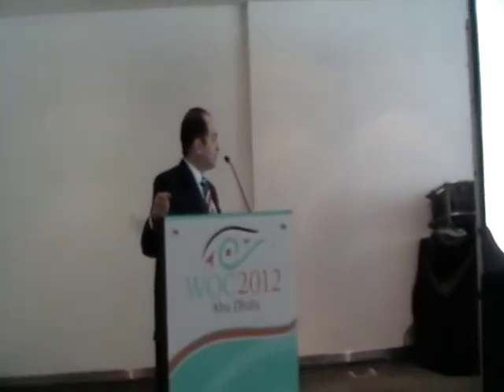In order to keep the central optic zone of the lens in the visual axis, the patients were asked to focus on the microscope light, and the reflex of the light was aimed at the center of the optical zone of the lens. The controversy here is around how we can find out the visual axis on a corneal map or whatever. Now, a few surgeons are using an intraoperative corneal map.